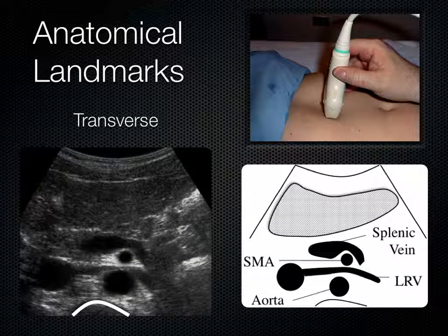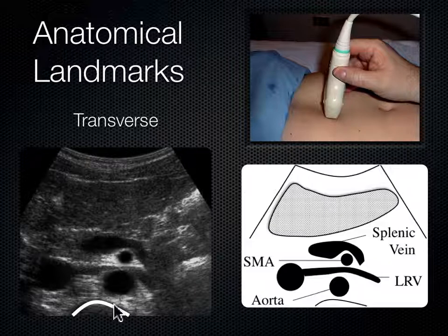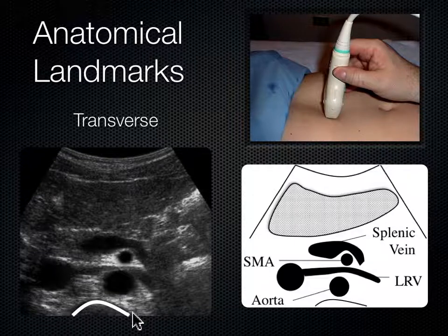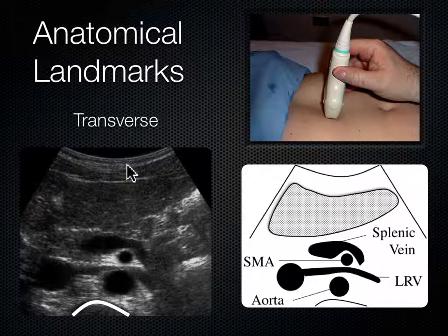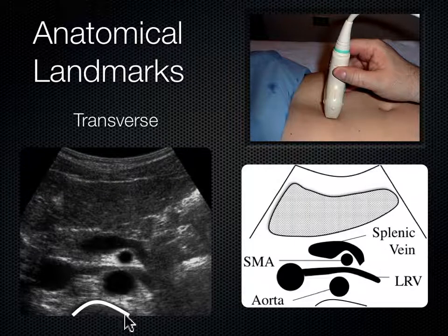Now turning the probe into a transverse plane — from parasagittal right, we aim the indicator to the patient's right to get a cross-section of the body. The first structure I identify is the spine shadow, where sound encounters the spine and bounces back. Moving anteriorly: the aorta is to the left of the spine shadow, and the IVC is to the right of the spine shadow.